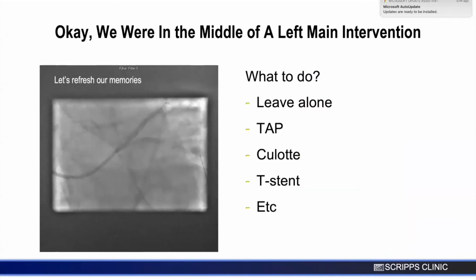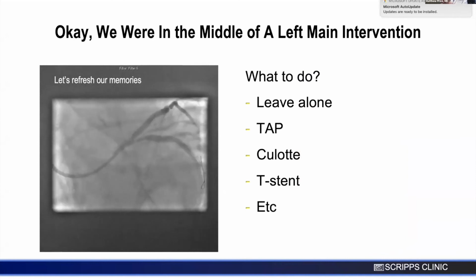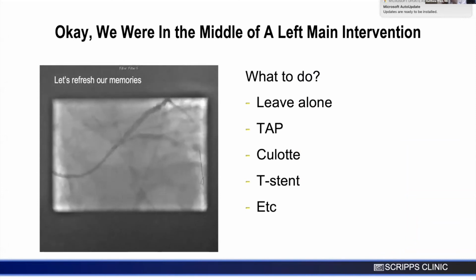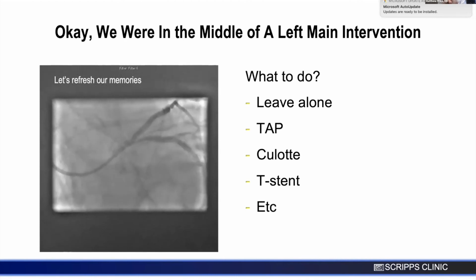All right. Do you do alternate high pressure inflations before you do the simultaneous kissing? Yeah, and what I do is I go up to high pressure with my stent balloon or a new NC balloon if I bring that down. And then I just go to like 8 atmospheres on both because I want to make sure that side branch stent is fully expanded. So I may go to full pressure on both and then alternating 20 down, then 8 on both. I tend to go up first in the side branch just to make sure that it stays fully expanded.